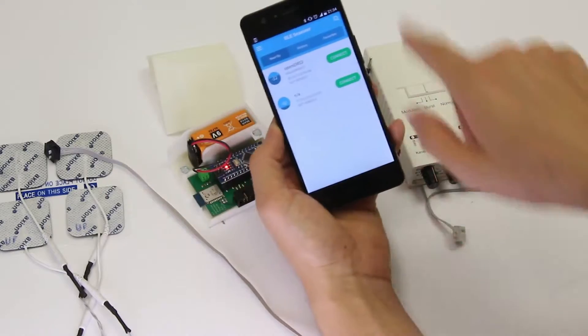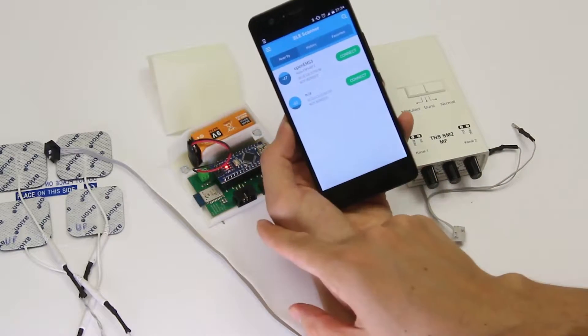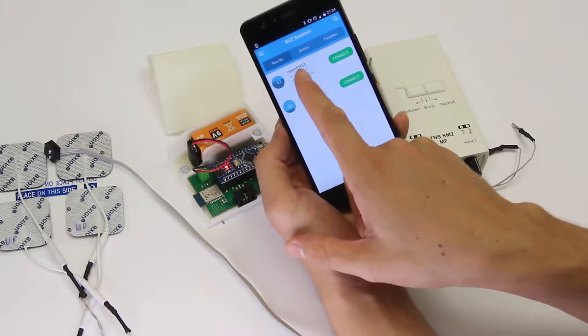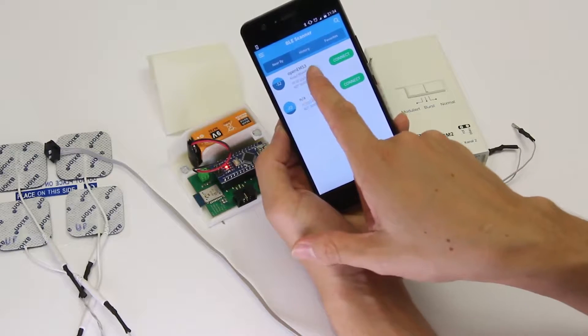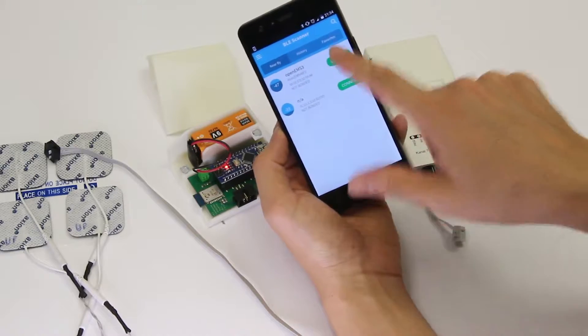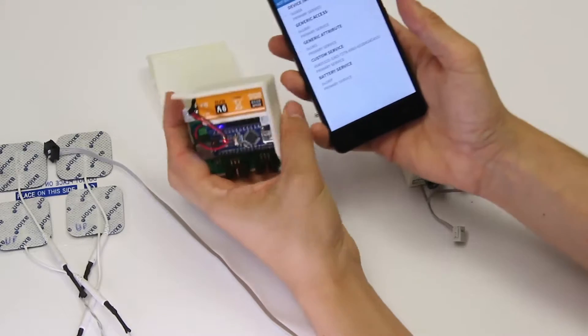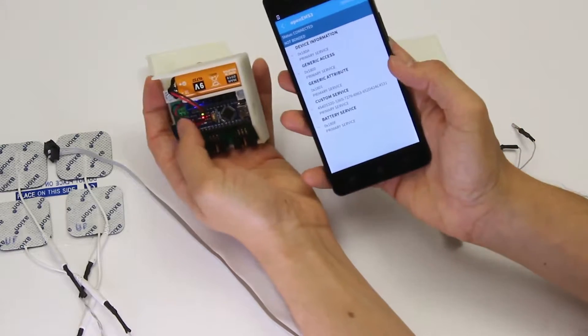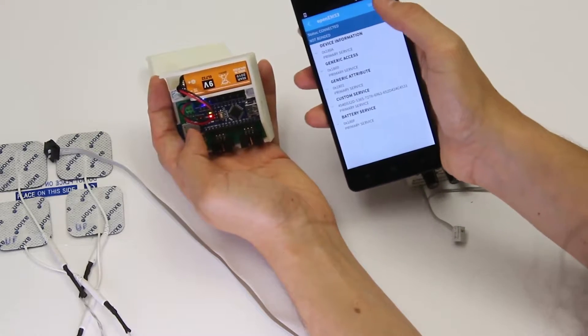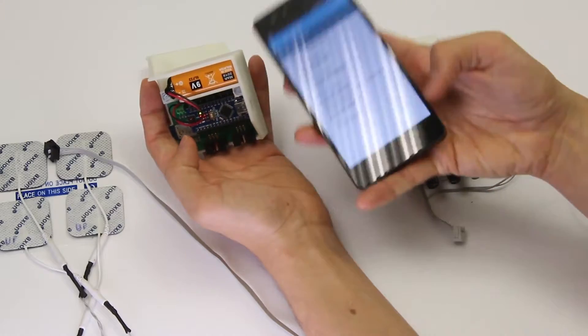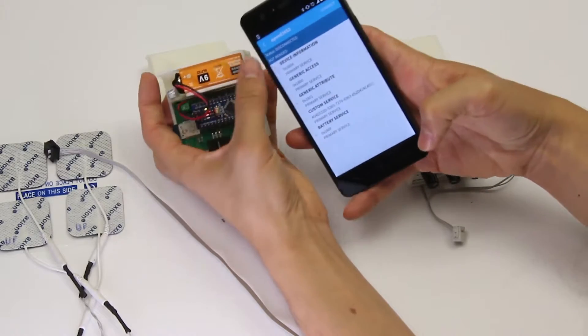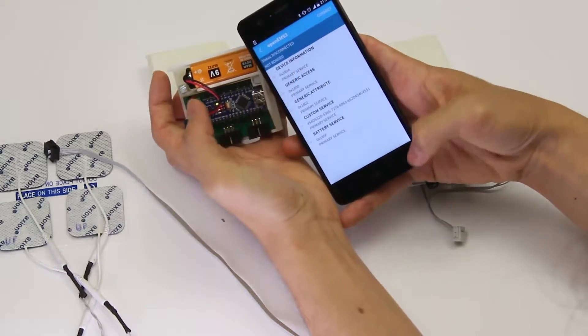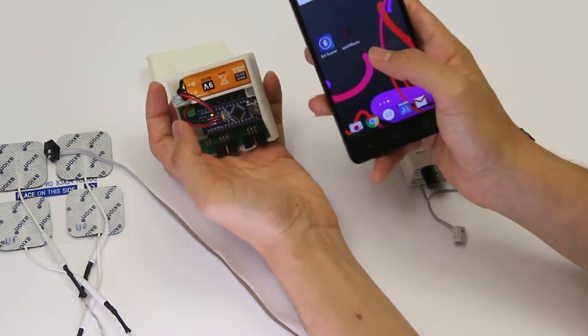As you can see it scans the surroundings and it finds a board called OpenEMS3. You can actually tap and say connect and look at that, there's a blue LED on the board that just lit up. If I say disconnect that blue LED goes off. So the connection between the board and our Android device is verified and it works.